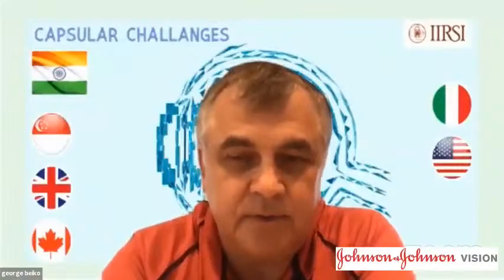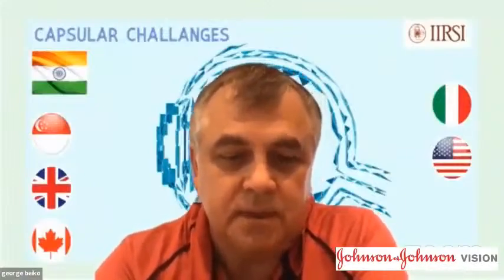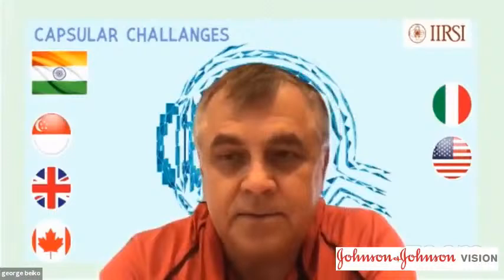On what Dr. Partha said, Abby, fantastic video. If you look at your UBMs, you can see that the whole bag IOL complex goes back, but the iris still seems to be anterior and blocking the angle. So my approach to these cases is not only to remove the cataract and put in the IOL and have that complex go back, but to address the angle. So I'll do a goniosynechiolysis, and then I'll also do a pupilloplasty, because that iris is very flaccid. Usually it's lost all of its musculature, and if you don't do a pupilloplasty, it'll come back up. Do you have any comments about whether or not you address that?